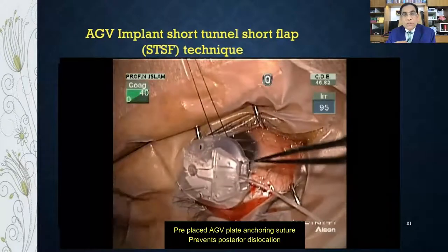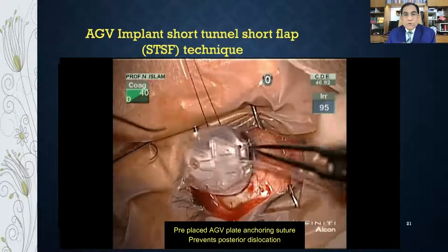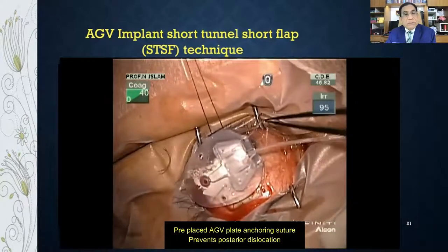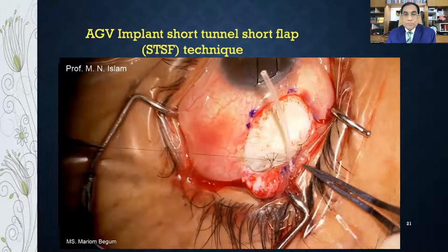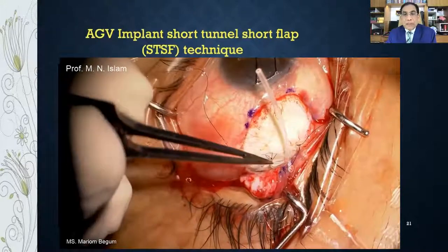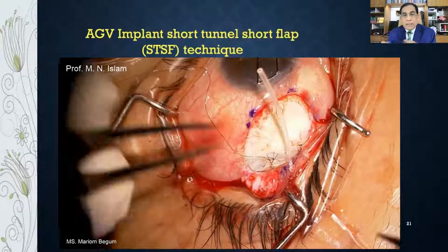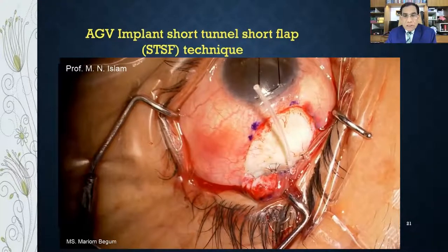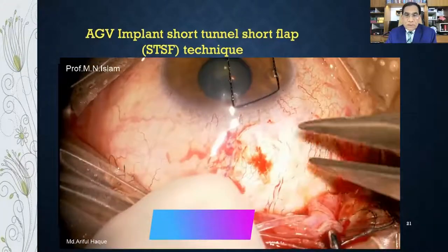I am demonstrating the preplaced suture of the plate — sometimes the plate can be lost posteriorly, so this prevents that. Then, anchoring the plate with 9-0 monofilament nylon — one or two bites — so the whole plate is secured to the sclera and does not move with eye movements.